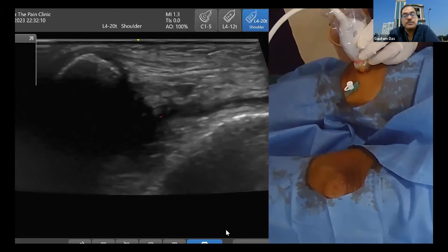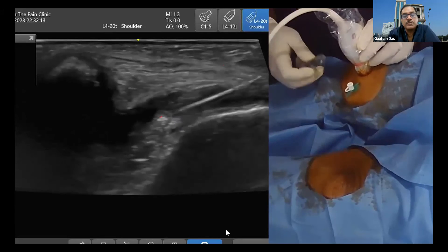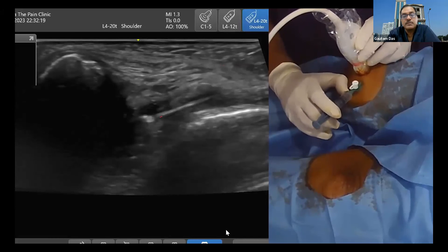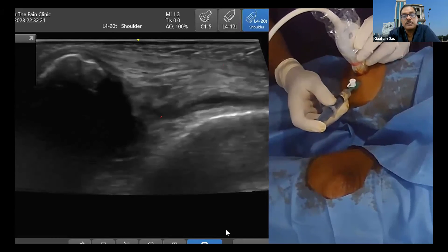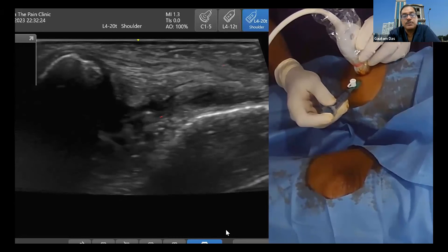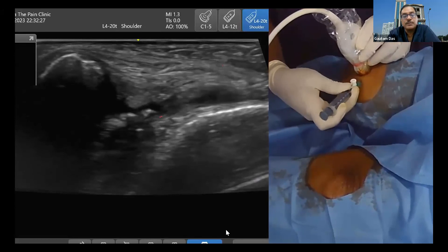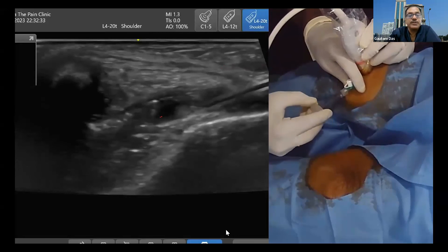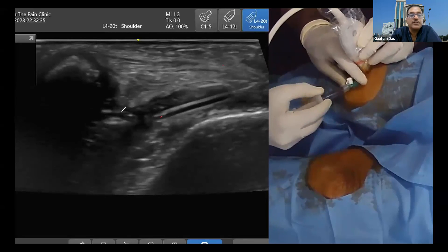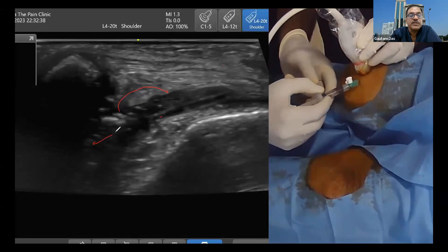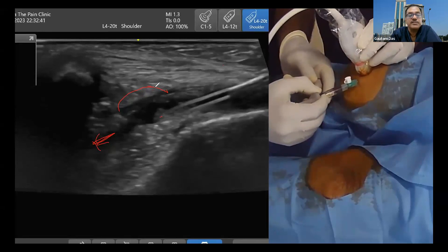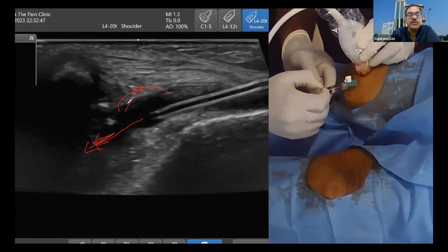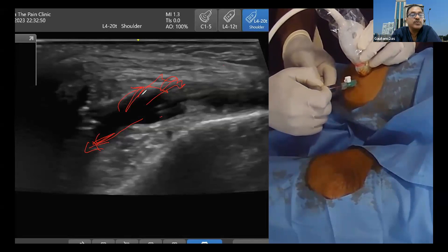Once the needle is in the proper position, we will be giving the PRP and the viscosupplementation. You can see the flow of the PRP drug inside. If you are in the proper position, it will not be bulging out — the fluid will be going inside. Now you can see the viscose being given; it is going inside. Nothing will be coming outside. If it is coming outside in this area, then you are in the wrong position.